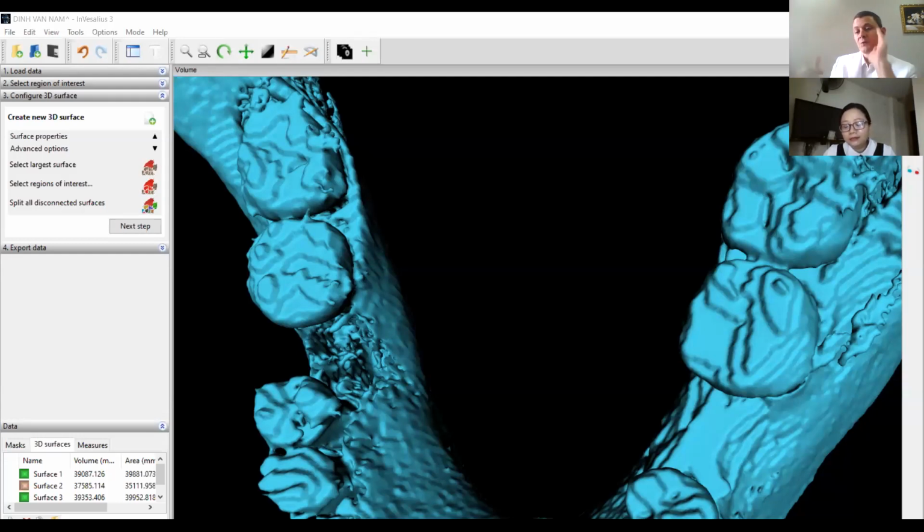And the second case he published was the same. In fact he had a series of 3 cases where the 7 were tipped, and in the fourth case he presented, he extracted the 7. He extracted the 7 and he closed the space because he understood that you cannot avoid this effect. But you have to understand, we are just starting to understand this. I heard about this from other orthodontists like three years ago, and now you have studies starting to come out. But the thing is, because we look at panoramic, we never understood this anatomy.